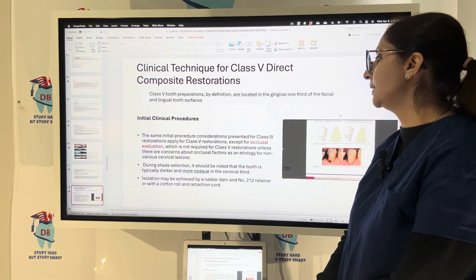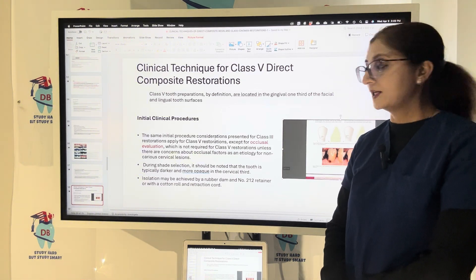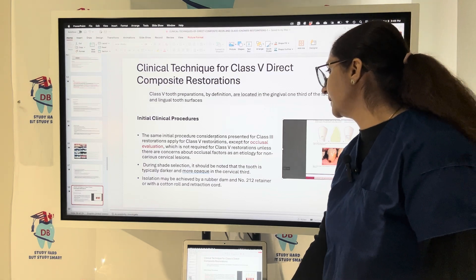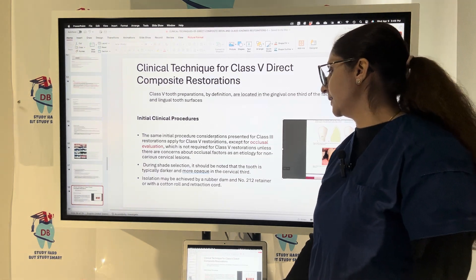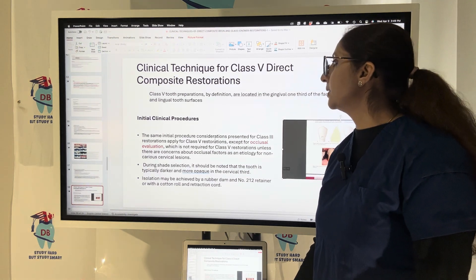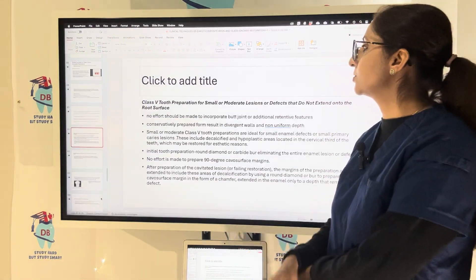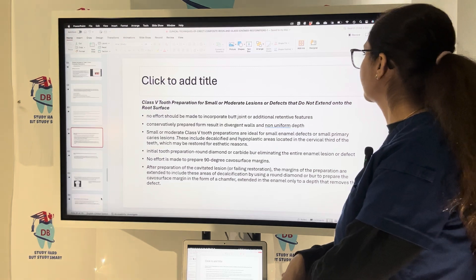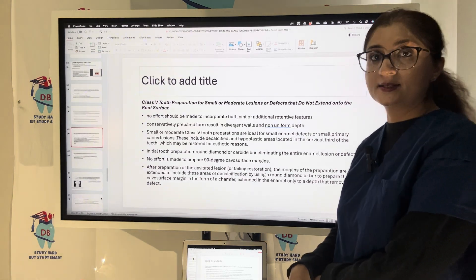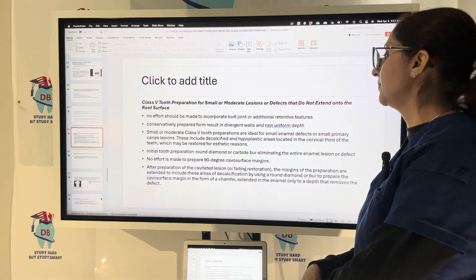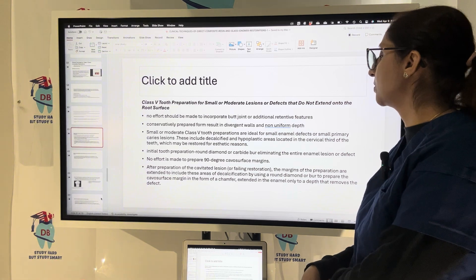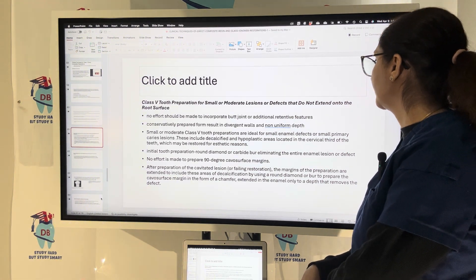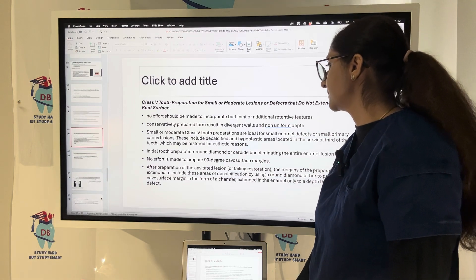The tooth is typically darker and more opaque in the cervical one-third. Isolation is achieved using a rubber dam with a number 212 retainer, or with cotton rolls and retraction cords. For small to moderate lesions not extending onto the root surface, conservative preparation results in divergent walls and non-uniform depth. This is ideal for small enamel defects or small primary carious lesions.